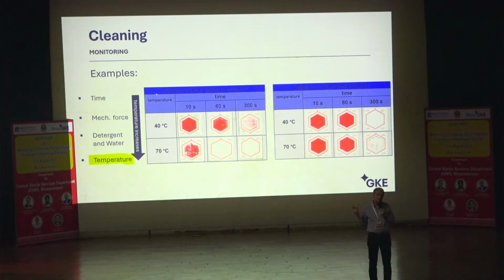The machine doesn't care. The machine simply says, you want me to work with 50 degrees, so I do it. I have no idea if it fits to the detergent. And here we have a nice method to do it. So this is the temperature.